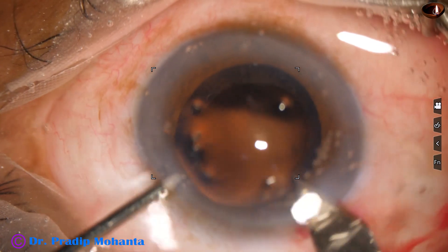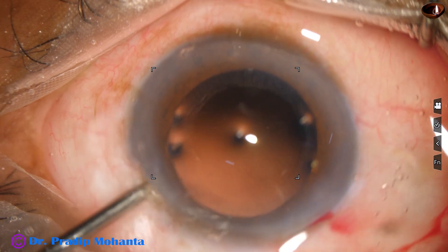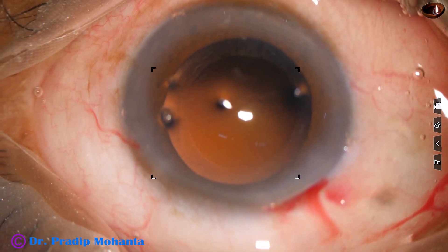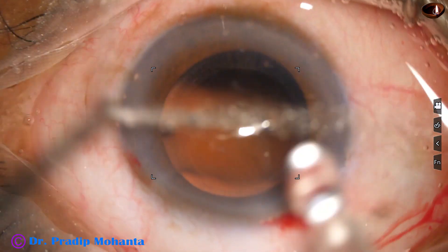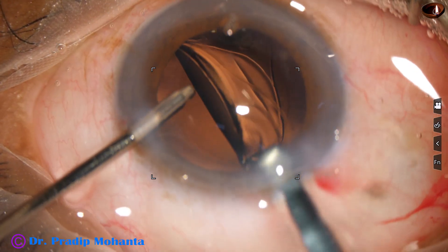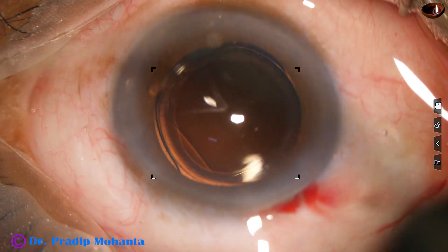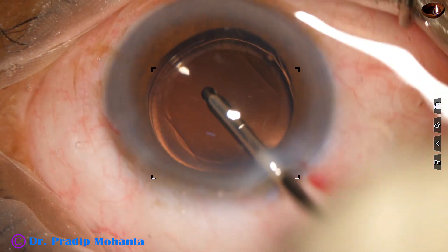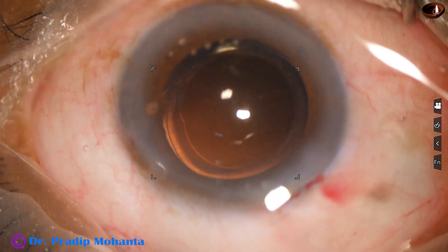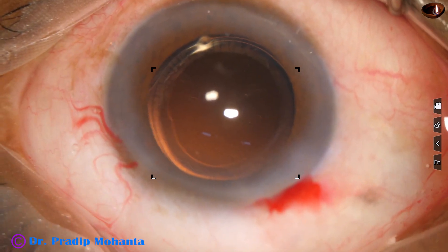I am using a cartridge for implantation of the intraocular lens, so enlarging the main incision a little more — maybe about 0.2 to 0.3 millimeter — so the main incision is now 3.1 millimeter. Here goes the intraocular lens. The lens has been placed in the capsular bag. We can see that the optic is being overlapped by the anterior capsular rim all around, so this is a rhexis of ideal size, about 5.25 millimeter.